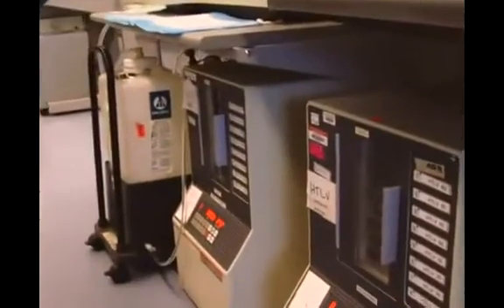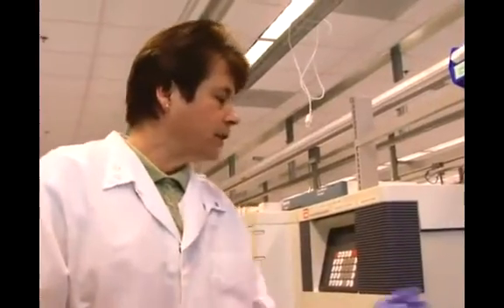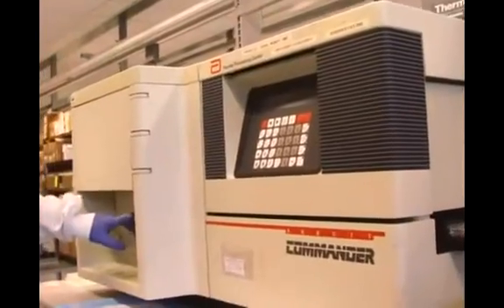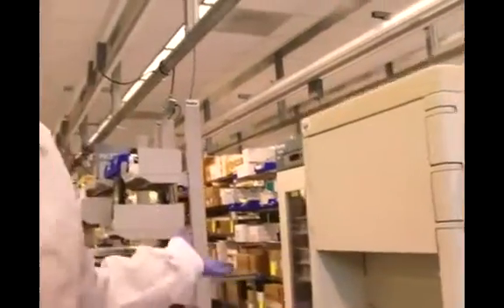After the incubation time, the tray will be taken out and processed in this instrument here — it's called a parallel processing center. Reagents will be added to the tray. This particular test actually has three passes, so we'll add a reagent to it.